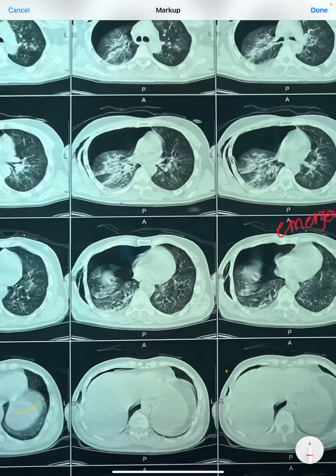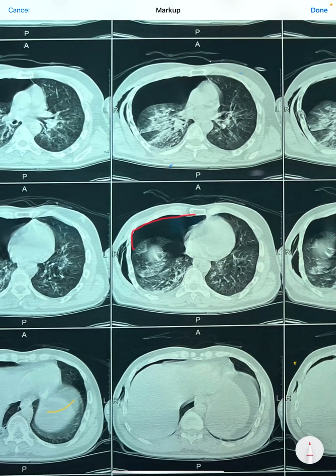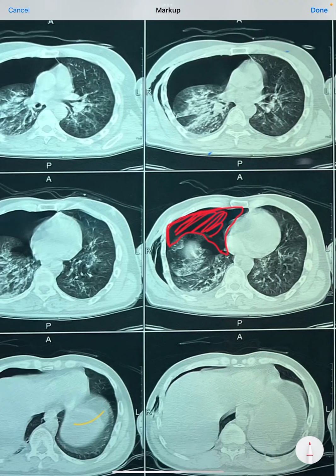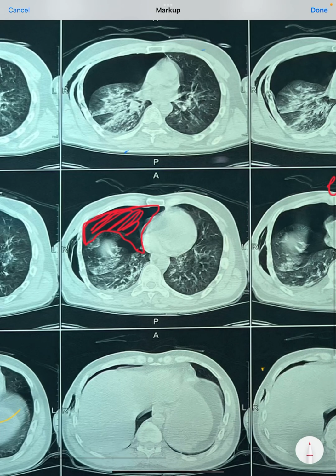Now we can see that this patient not only has the pneumothorax, which is the presence of air in the thoracic cavity, but also has subcutaneous emphysema. Subcutaneous emphysema means, see, when we zoom in, this is bone, this is a dense white structure, this is vertebra, these are ribs, and this slightly radiolucent or blackish structure is all fat.